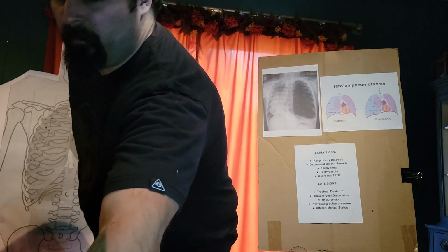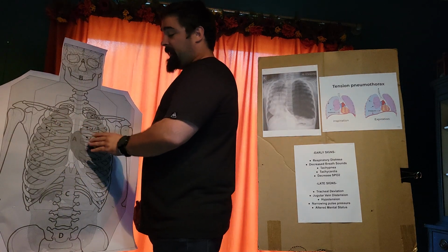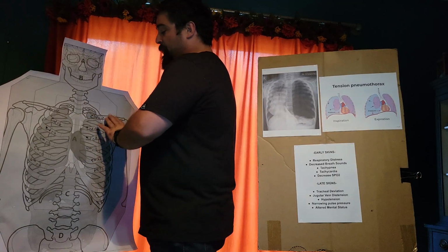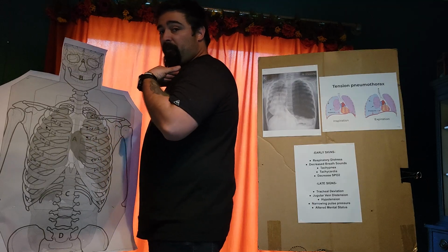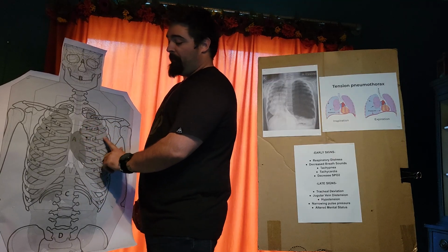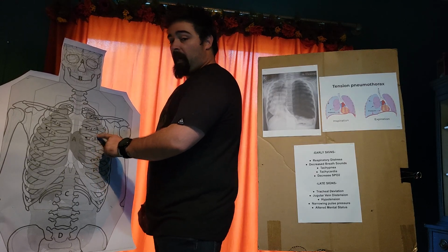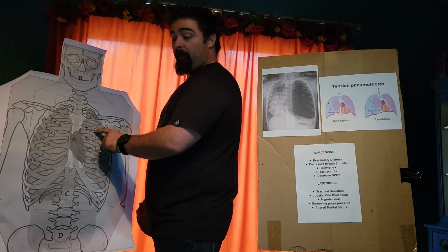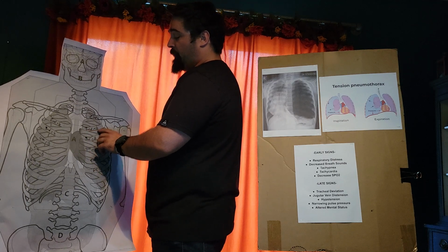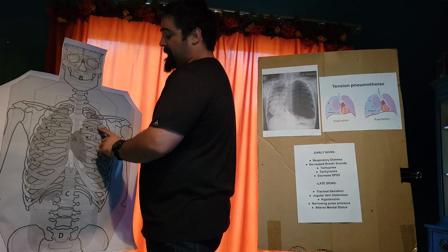So we're going to palpate the anatomy for the mid-clavicular site. We're palpating down, so the clavicle, depending on the anatomy, depending on the size of the patient, will typically cover that first rib. You're not able to feel the first rib underneath the clavicle. Down to the second rib, palpating down now to the third rib. We want to pierce over the top of the rib, not underneath the top rib. Underneath each rib, there's bundles of vasculature and nerve bundles that will, one, cause pain, and then also have an impact on the effectiveness of the NCD.